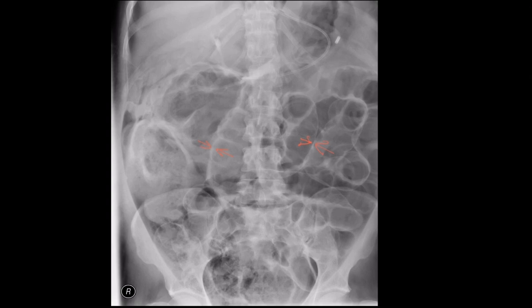In this image you can also see the football sign. There is a large ovoid area of lucency which resembles an American football. This is also a sign of free gas within the peritoneal cavity.